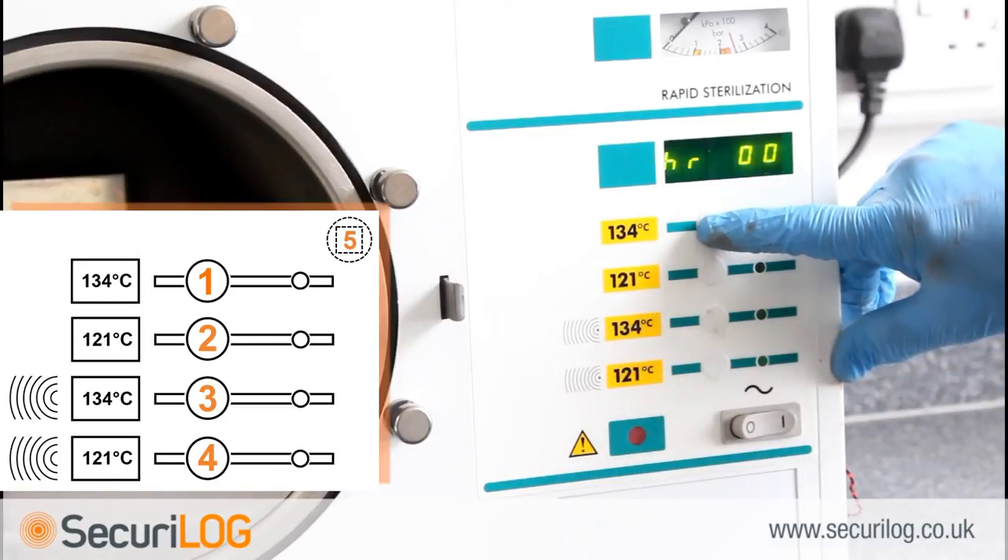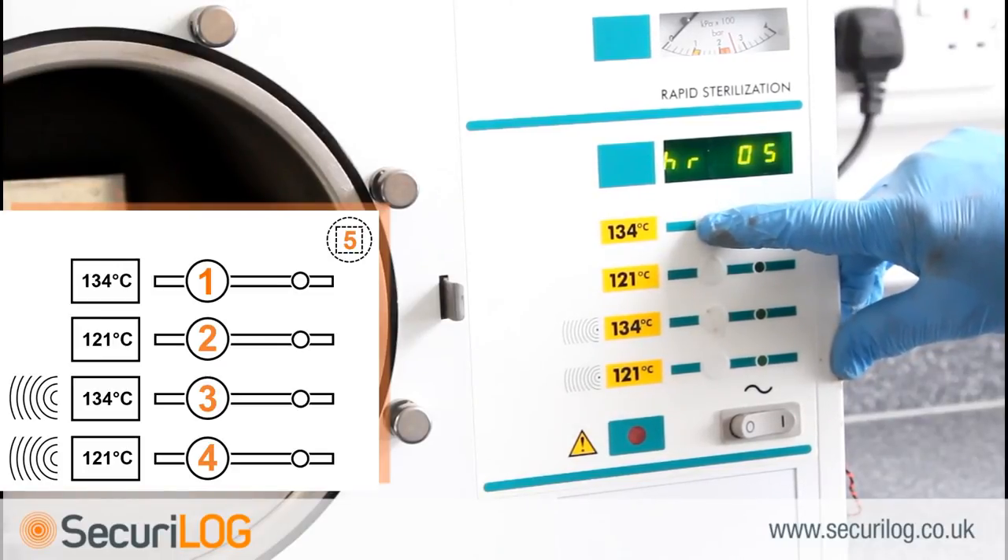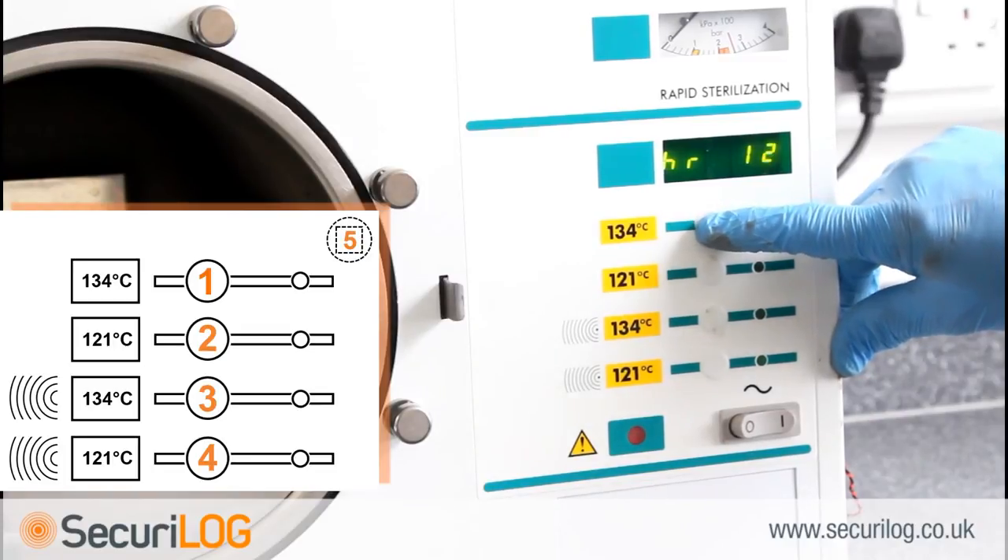The hour uses a 24 hour clock, 00 through to 24. With the display reading HR00, press button 1 to begin selecting the required number. Button 1 increases, button 2 decreases. When the number displayed corresponds with the hour, press 3 to select.